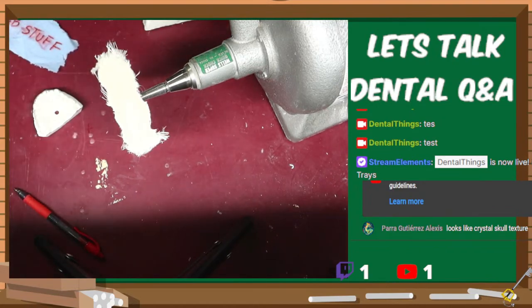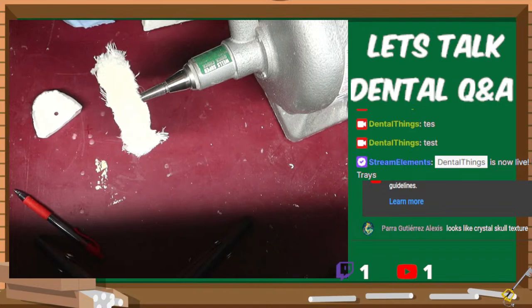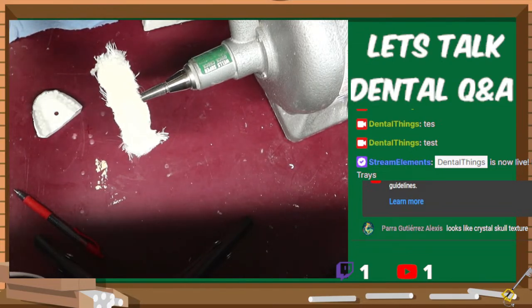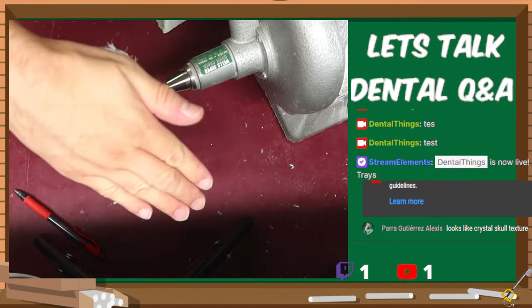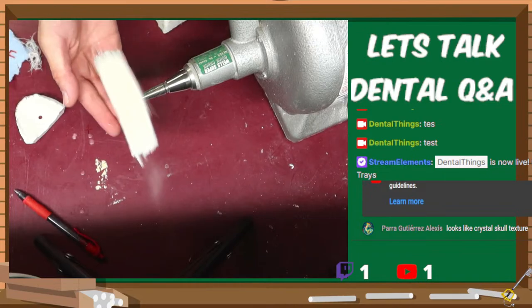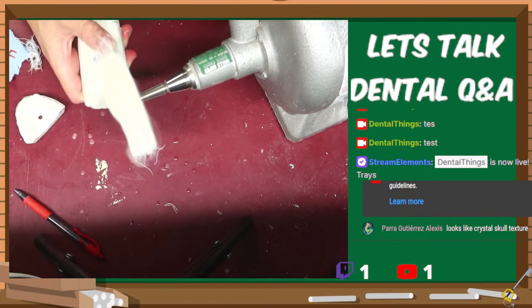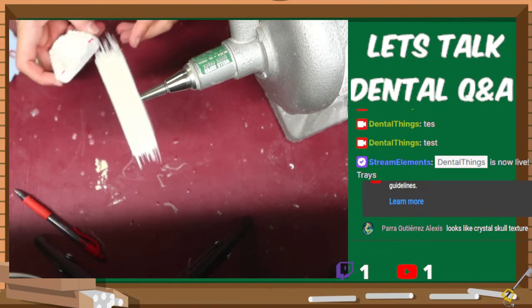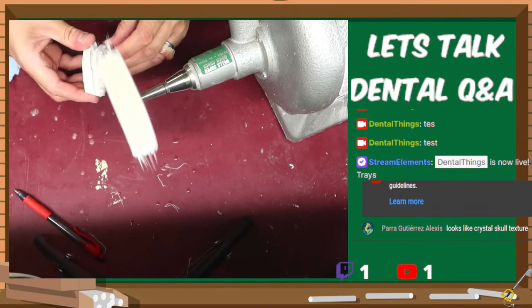I need to make sure my lathe is hooked up. So where is my, here you are. There's my lathe. I can take this out. And let's go into that. And let's turn it on. A lot of flying pieces on there, but I need a little bit of water. And with that water on there, I'll use a little bit of my polisher. A lot of hairs flying everywhere. And then let me just hit it with a little bit of shine.